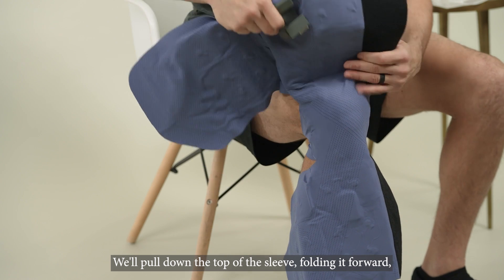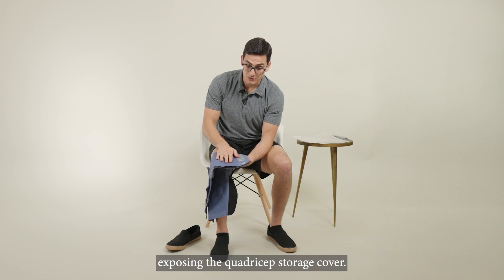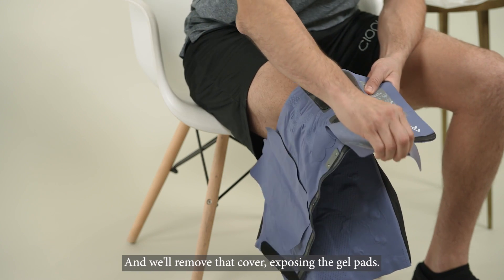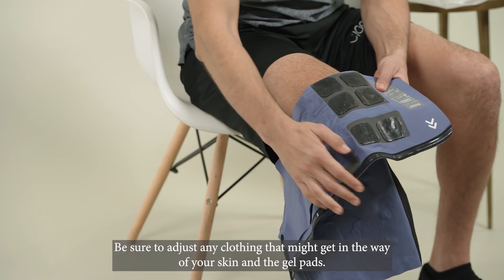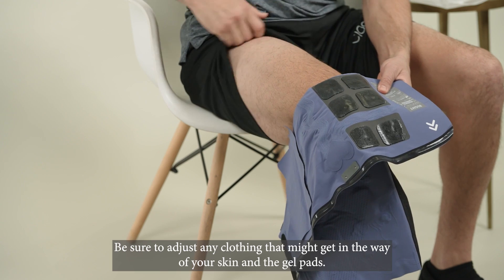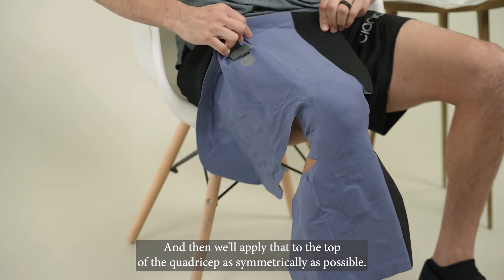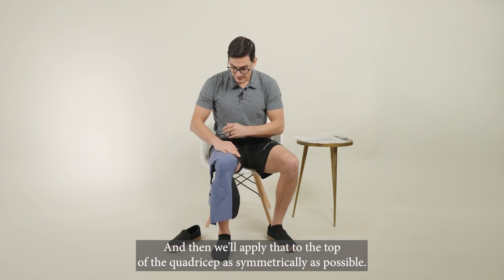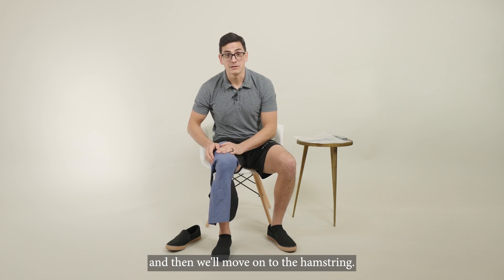Your kneecap should be in the center of the sleeve. We'll pull down the top of the sleeve, folding it forward, exposing the quadricep storage cover, and we'll remove that cover, exposing the gel pads. Be sure to adjust any clothing that might get in the way of your skin and the gel pads, and then we'll apply that to the top of the quadricep as symmetrically as possible. Press those in place, and then we'll move on to the hamstring.